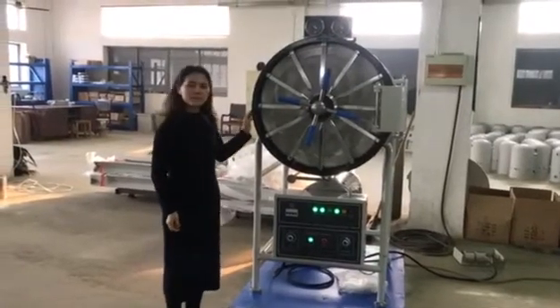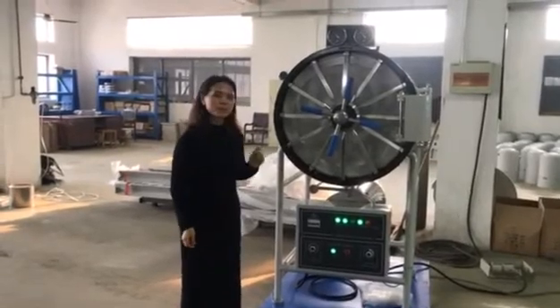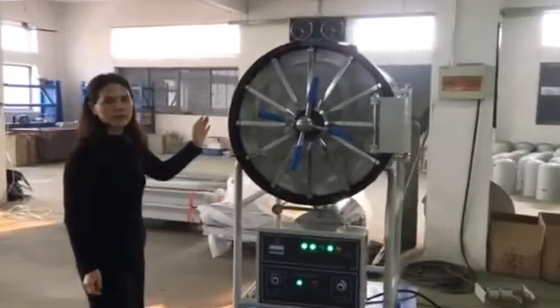Hello everyone, my name is Kerry. I introduce one horizontal pressure steam sterilizing to you. This model we stored very well in the world market.